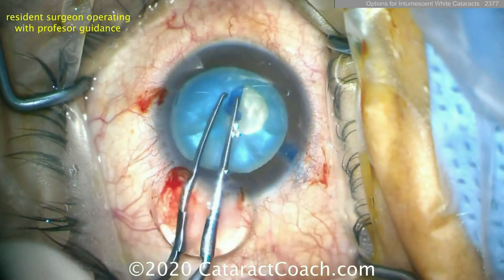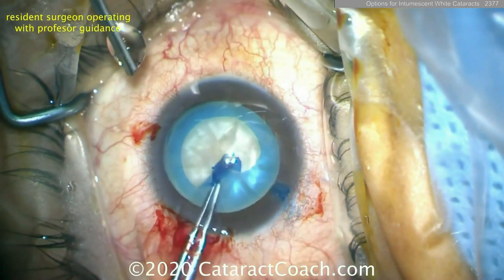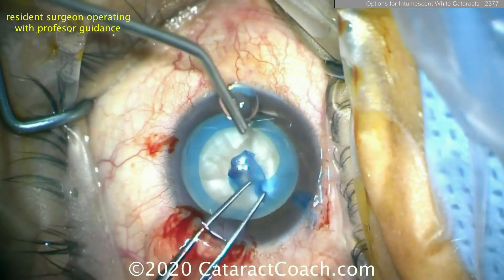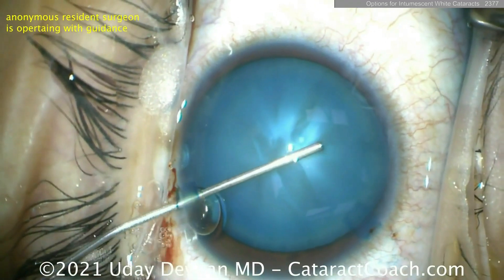At this point it's decompressed enough that you can get a complete rhexis done. And this is a resident surgeon who's operating — so nice, complete rhexis there.